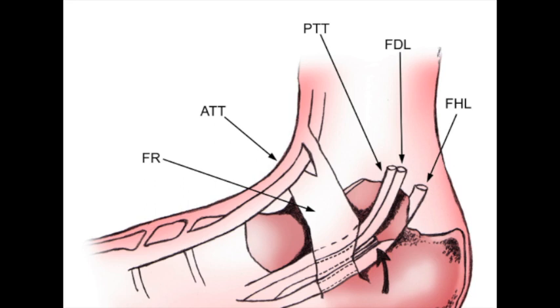More posterior to that is the FHL, flexor hallucis longus. Now between the FDL and FHL, you will visualize the tibial artery and nerve running between those two structures.